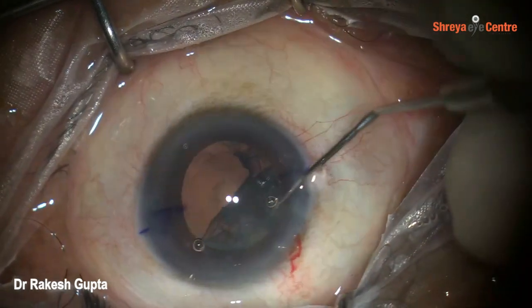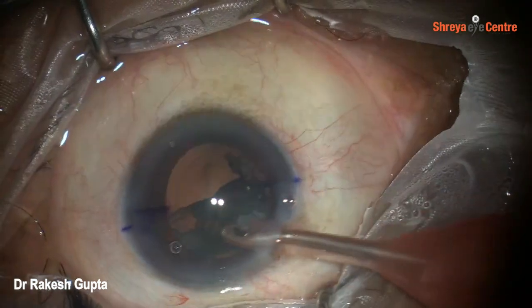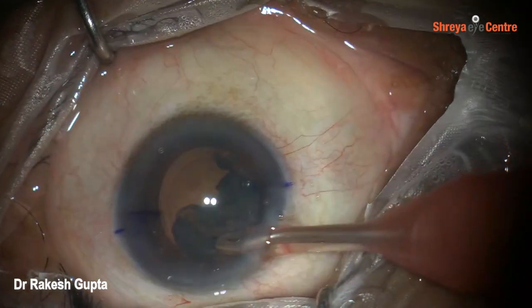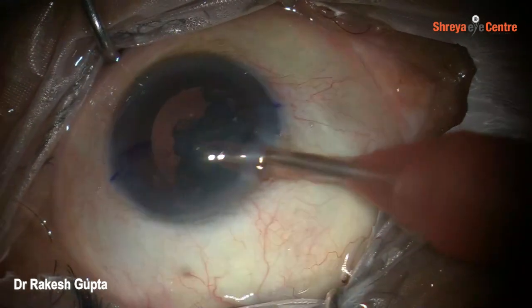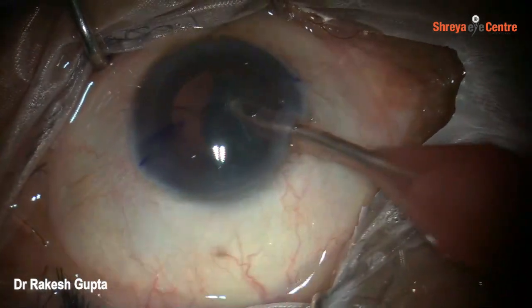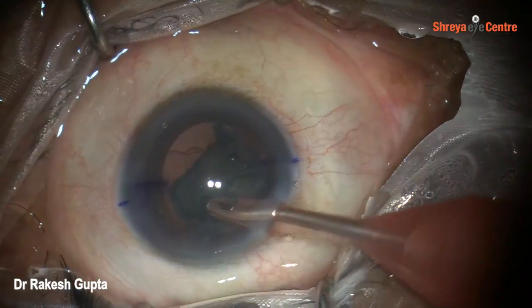So here is my first tip, do use dispersive viscoelastic over the posterior capsule as well as over the rent, because it acts as a pseudo-vitreous and it prevents suction of the posterior capsule as well as vitreous. As you can see, I have rotated the upper part of the cataract towards the center and then I am gently aspirating the remaining cataract. Yes, I am keeping patience and going slowly. This complete surgery took approximately 32 minutes, but I have edited and clipped the irrelevant portions to make it short.